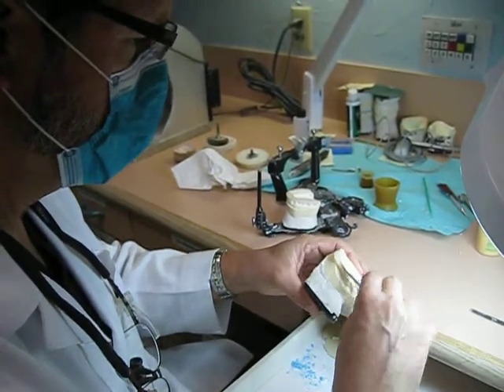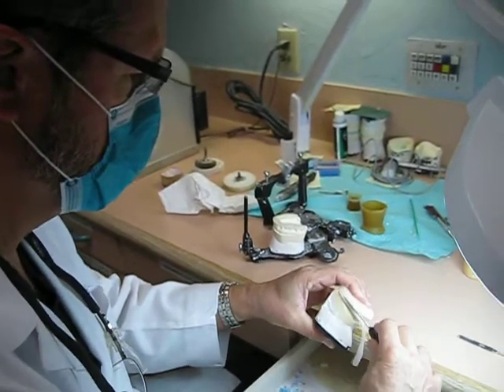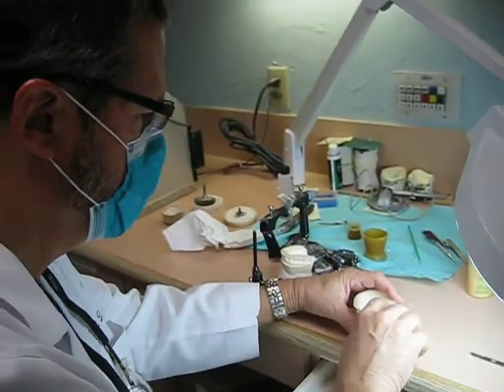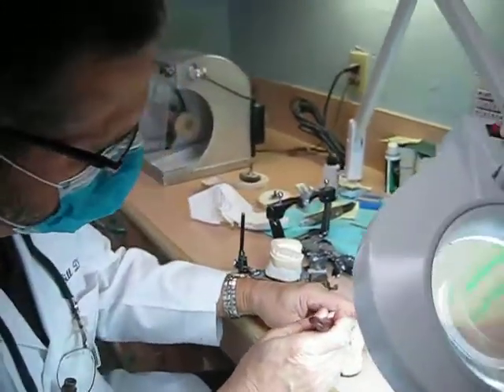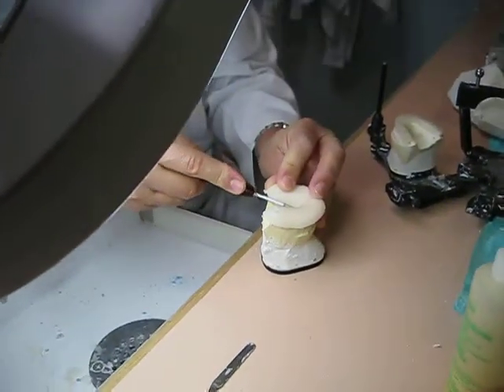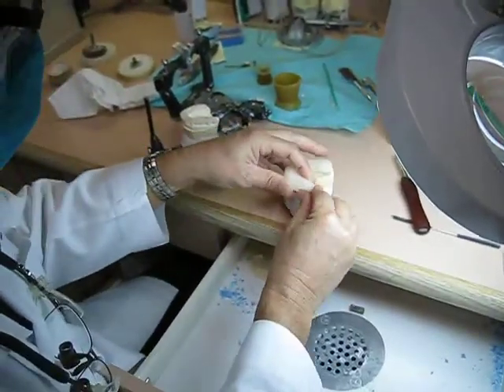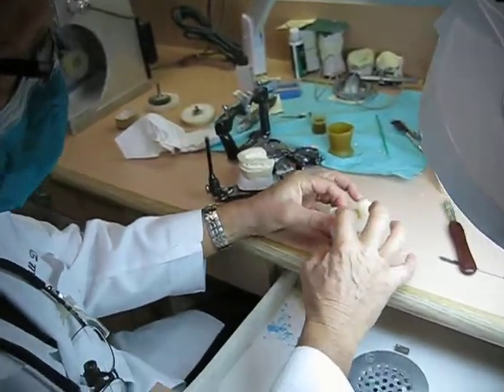But for those of you who are not in the dental profession, we go to about the gum line at first. Don't try this at home. I'm used to whittling with scalpels, and I wouldn't recommend that. Turn away if this makes you squeamish. Okay, so right now that's what I'm going to do. Now, it's still pliable, as you can see.